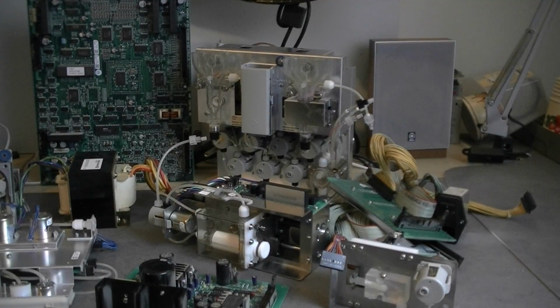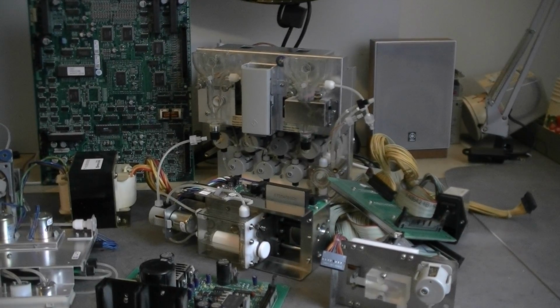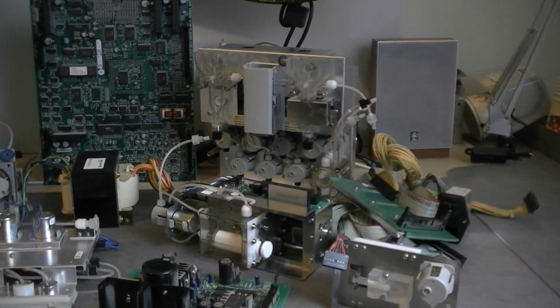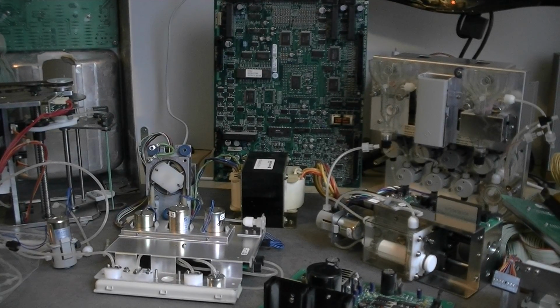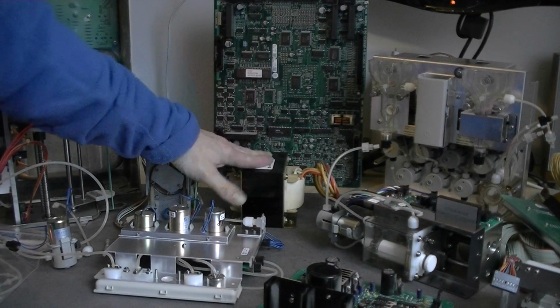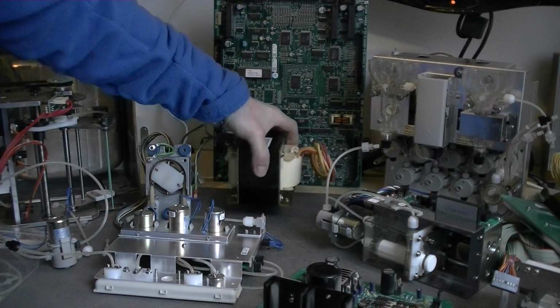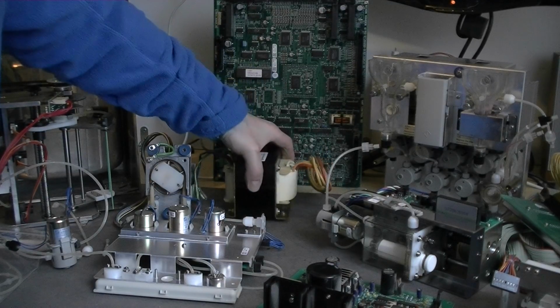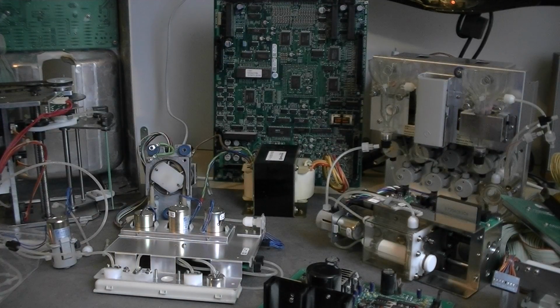So in the upcoming videos, we will have a detailed look at everything. The case itself is already ready for going to the scrapyard because it was very bulky. Most of the weight was the cover on the back of the case, which was steel, and of course this gigantic transformer, which must be at least 3 or 4 kilos. Really heavy, this thing. Apart from this, the rest of the case was aluminium, so it was quite light.